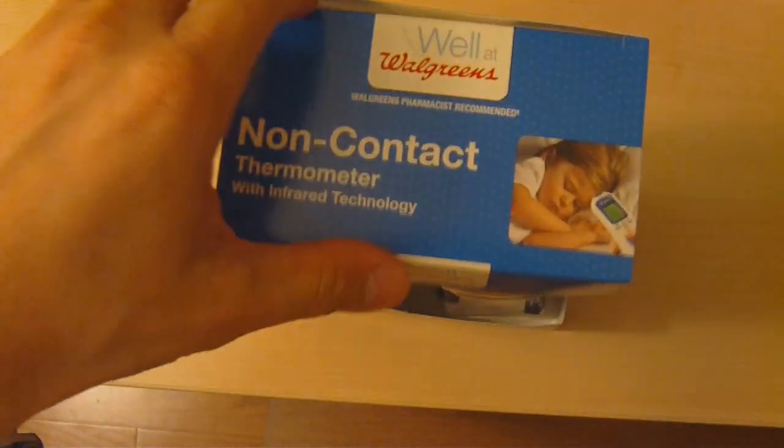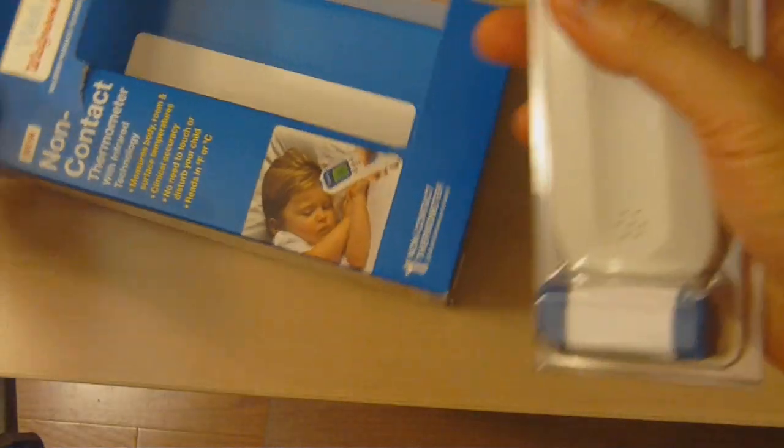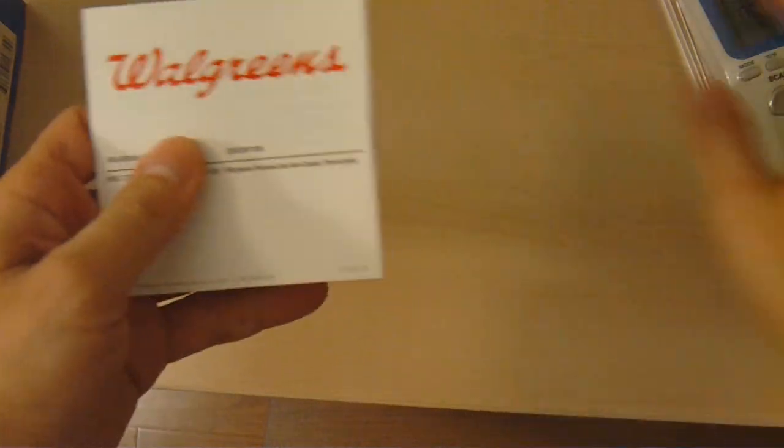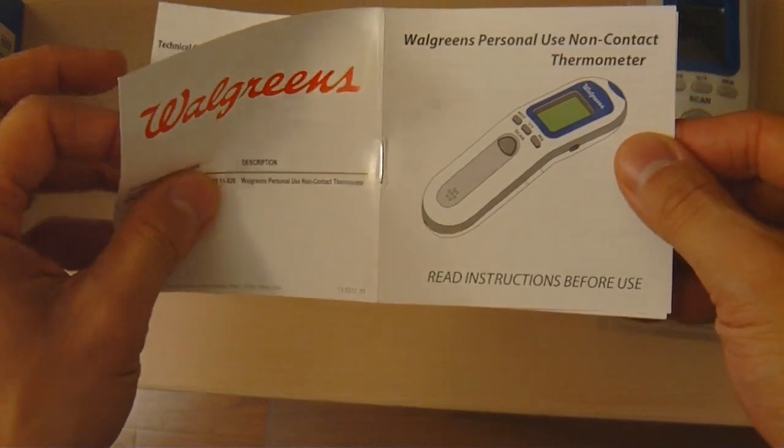As we unbox, we see two batteries here and the box is actually pretty plain. There's a manual — let me pull that out. This is the Walgreens manual and it says to read instructions before use. We've kind of looked over the manual a little bit and the instructions that were on the box.